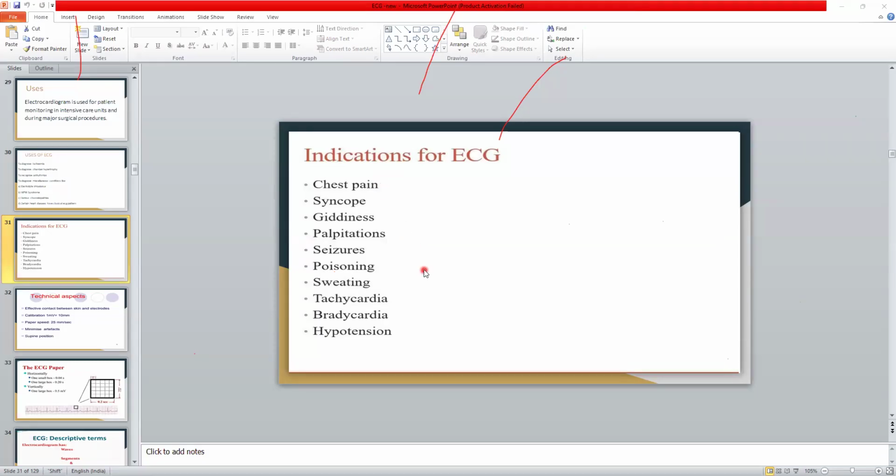Most of these symptoms may disappear or will occur minimally in patients associated with comorbidities like diabetes, hypertension. So whenever the patient comes with a history of certain complaints like chest pain or syncope, it is always better to go for the ECG examination, ECG investigation.